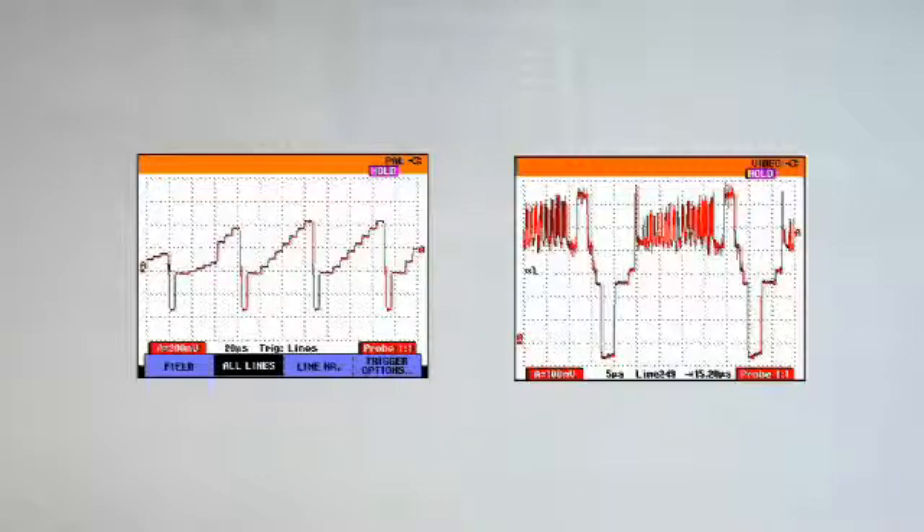High-resolution, non-interlaced video signals like those found on today's fluoroscopic and angiographic systems can be easily evaluated with the scope meter, as well as the ability to trigger on standard interlaced video signals.